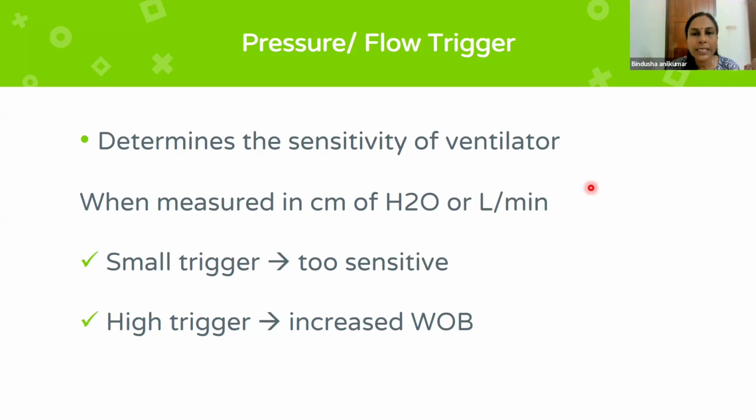So the patient has to generate so much effort for the ventilator to determine that the patient has started breathing, so that it may actually increase the work of breathing. So it's always important that we set an appropriate trigger whenever we are setting the ventilator. That is important. Okay.